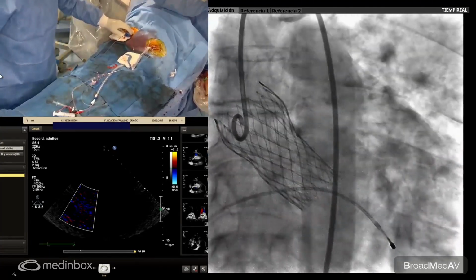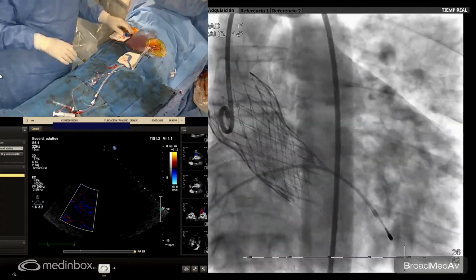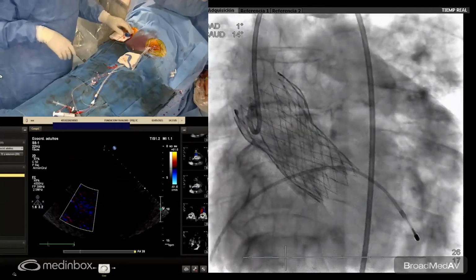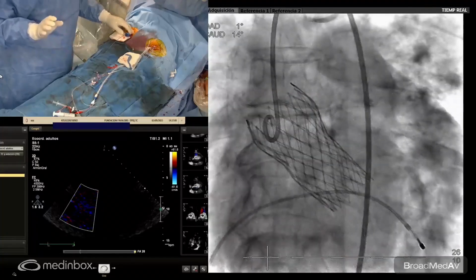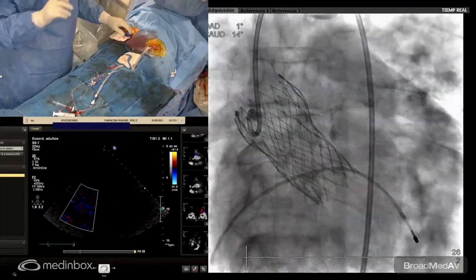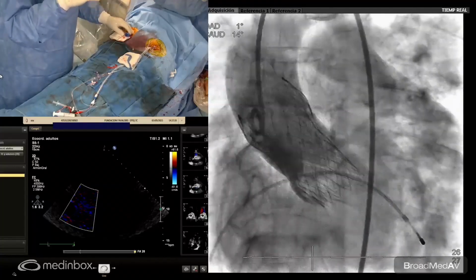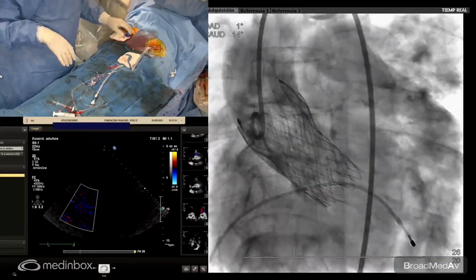Okay, we still have a diastolic filling there in the left coronary sinus, but the other is okay. The height of the valve is okay. In the first view, everything is out. Well, okay, it's not absolutely nice, but it's okay. We also have a very nice cusp alignment. You can observe there the left main ostium completely free without any post of the valve facing the left main.